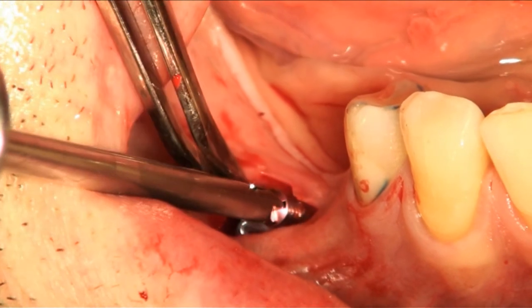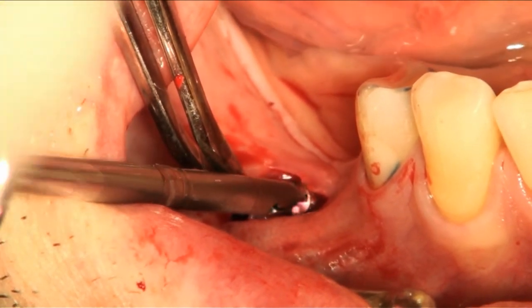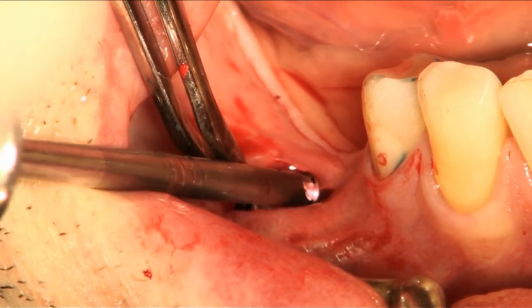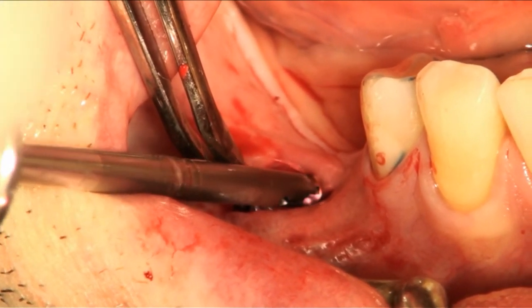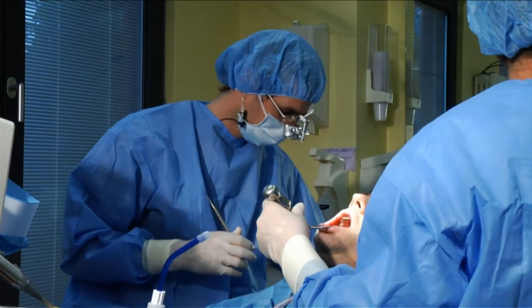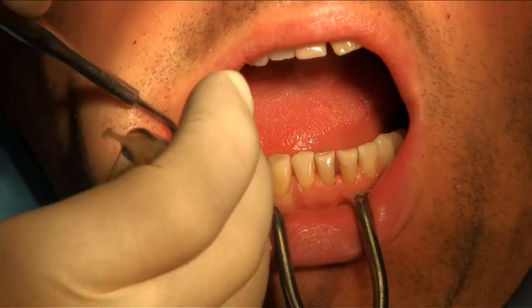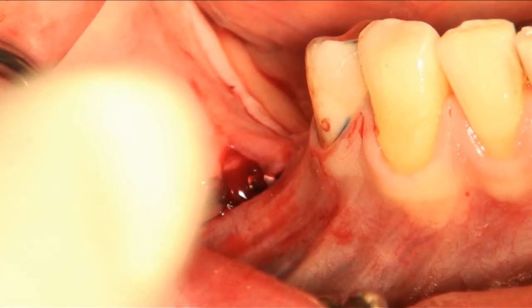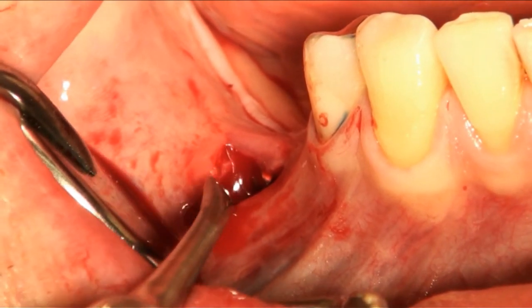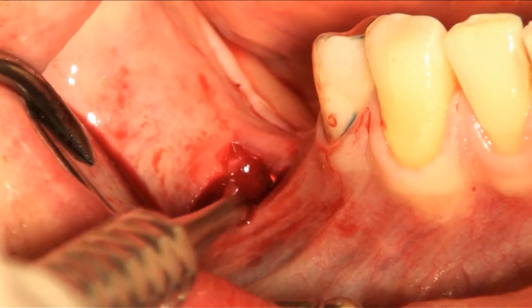Now the expander is placed into the pouch and we fix the bone fixation screw. The expander is placed and fits loosely into the pocket.